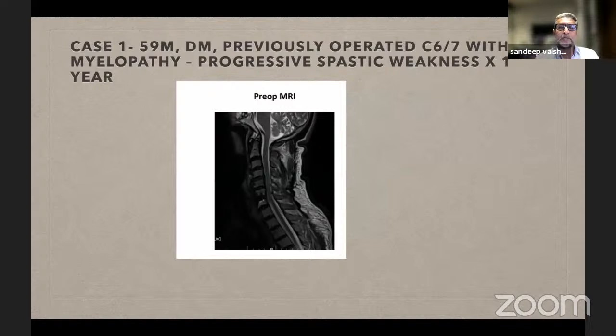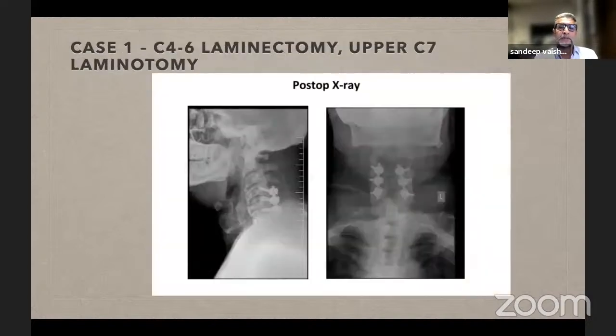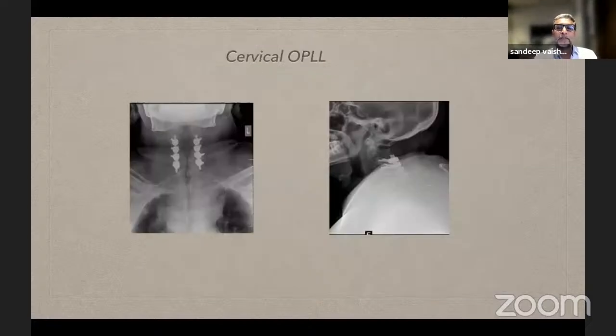Again, this was a patient who had a previous anterior surgery and had significant myelopathy and progressive spastic paresis. So we did a posterior decompression and lateral mass fixation. Again, another patient with OPLL.